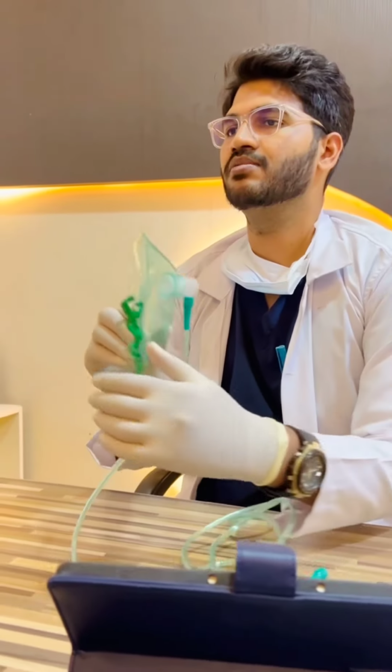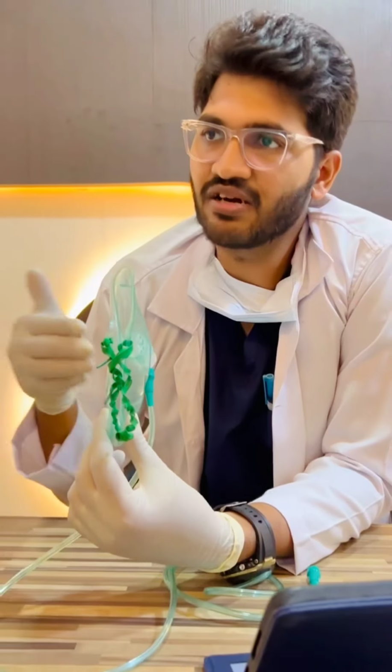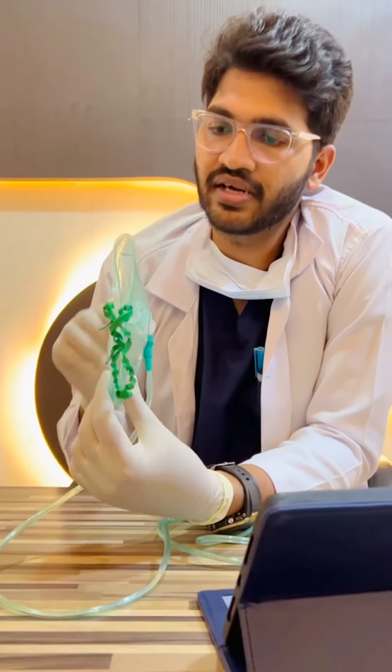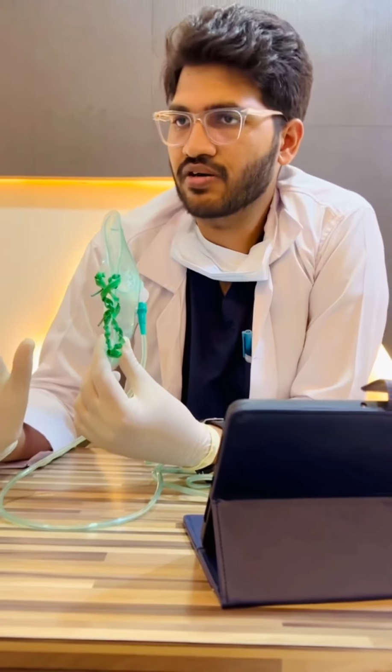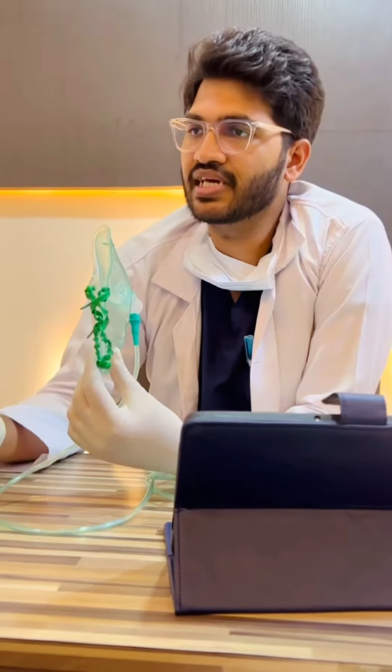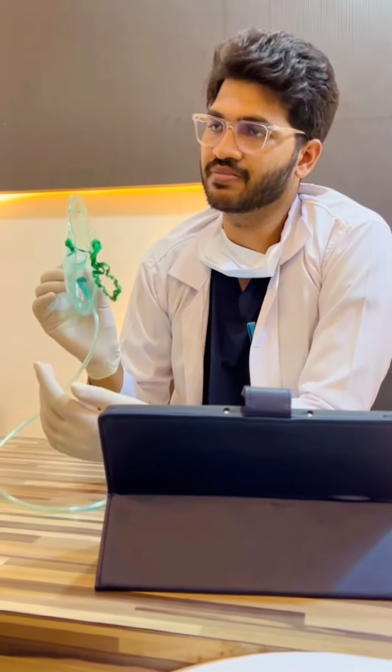Next we will talk about the simple face mask. The higher the flow rate, the higher the percent of oxygen delivered. The faster the patient breathes in, the more air enters by the side of the mask with the flow of oxygen, diluting the oxygen that is inhaled. So roughly 35 to 50% of oxygen is delivered, depending on the flow rate. These are the things we have to consider in the simple face mask.